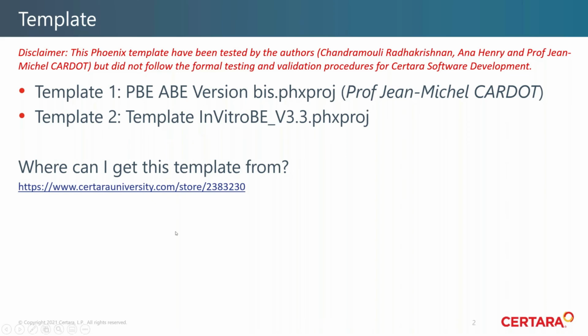A couple of things we would like to point out: the Phoenix template has been tested by the authors. In this case, it's going to be myself and Anna Henry, and also Professor Jane Michael as well. This particular template did not follow the formal testing and validation procedures for Certara software development.